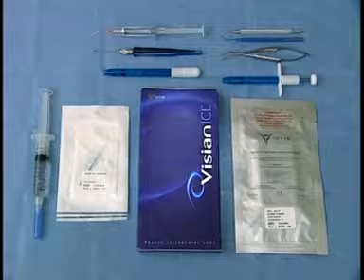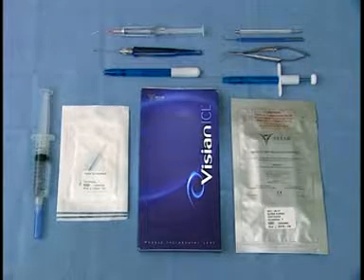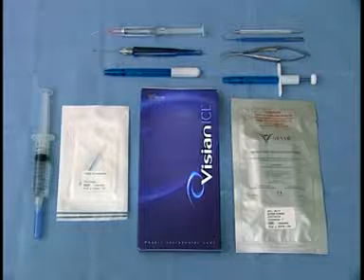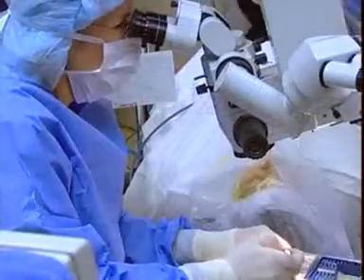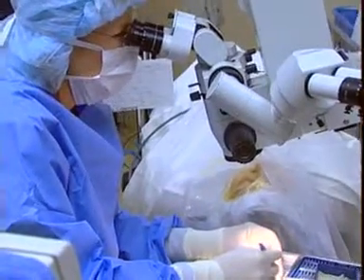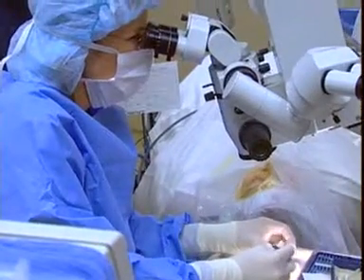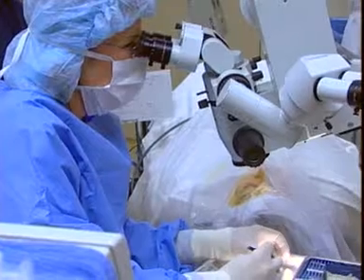Using the Star ICL injection system, the ICL is injected through the MSI-PF push action or MSI-TF twist action injectors. The SFC-45 cartridge requires a 3 to 3.2 millimeter incision. The loading of the ICL is a critical component of the overall procedure and should be performed under the operating microscope. The delivery of the implant into the anterior chamber is largely dependent on the precise and careful loading of the ICL.